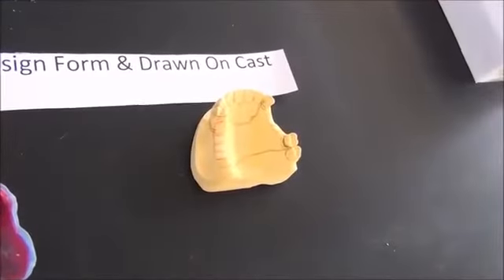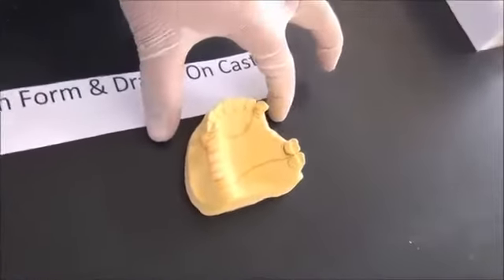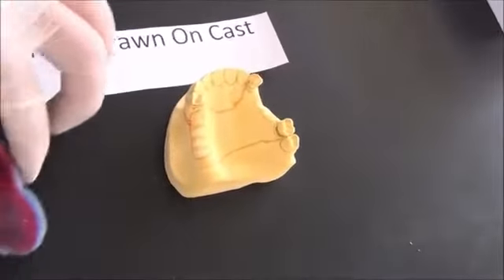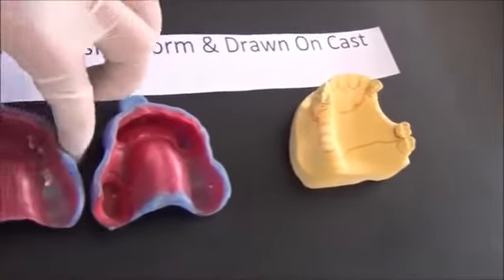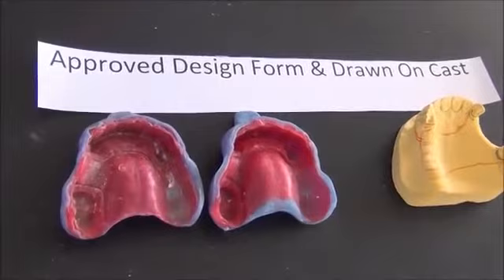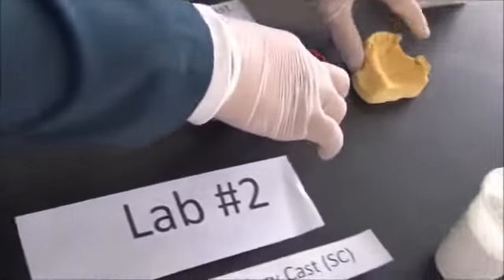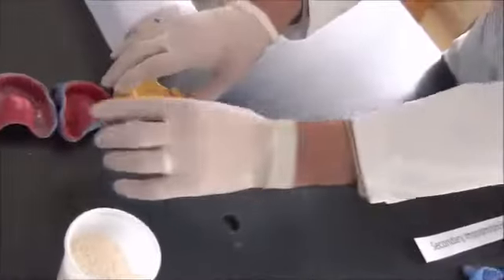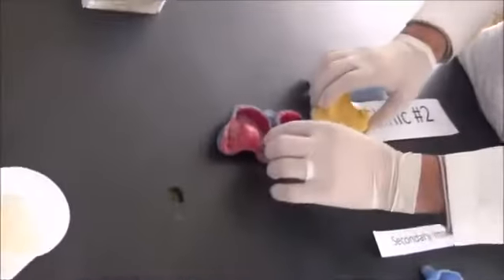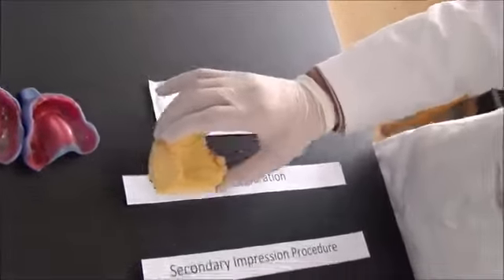As students, you should take an approval for this design from your supervisor. And the dental technician will also provide special trays to take impressions. These 2 go back to the clinic, casts with their special trays, and now we begin a process called tooth preparation.